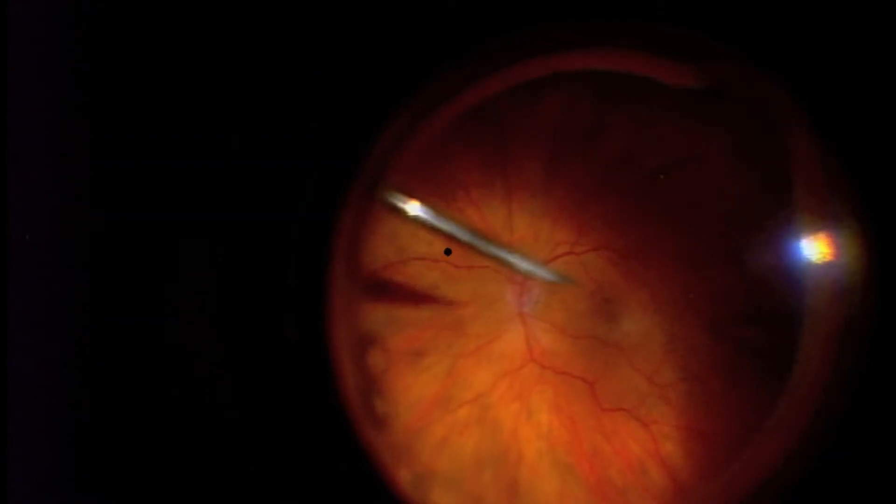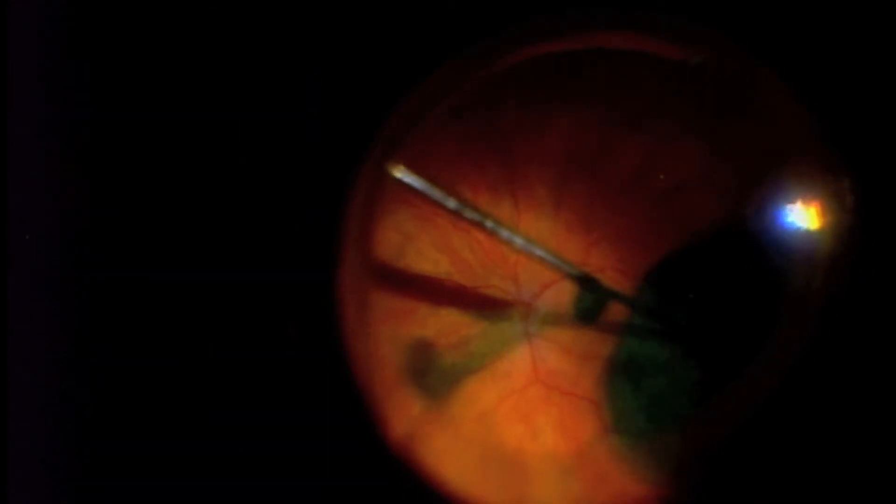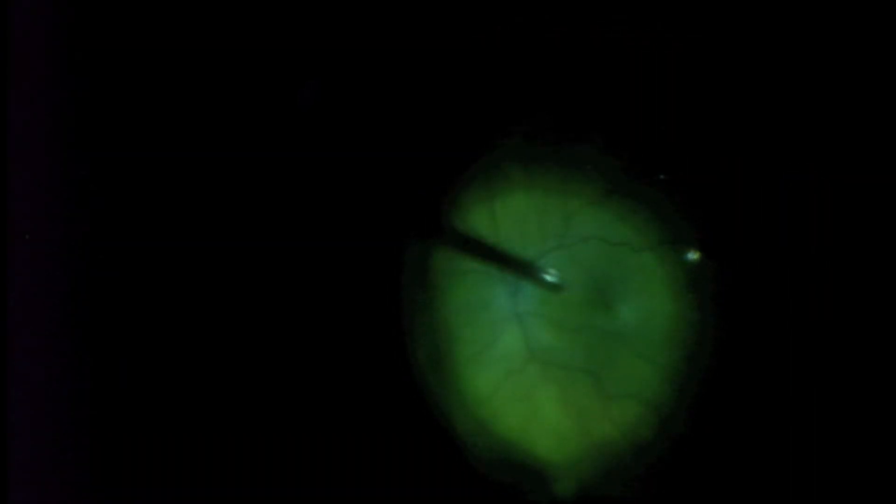After removing the vitreous, I usually inject a very dark green dye. It's called ICG. As it's removed from the eye, only the tissue on the surface of the retina becomes stained.